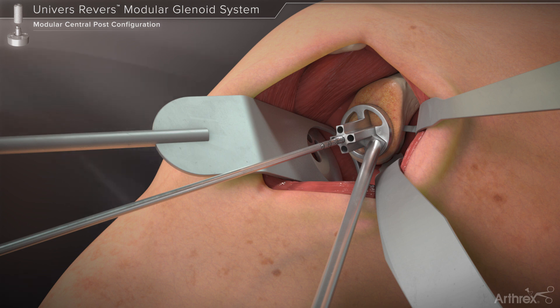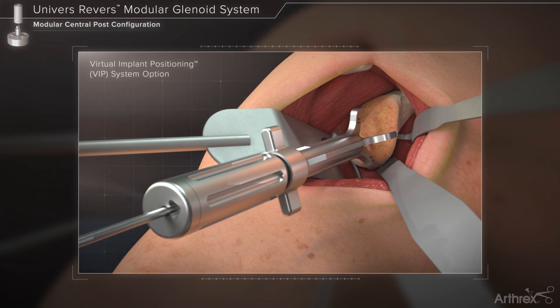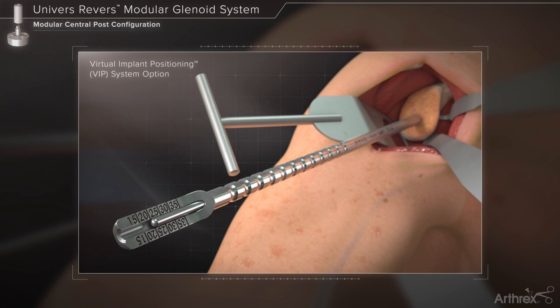A determination of the central post length can be made by noting the laser markings on the pin shaft. Alternatively, those using the virtual implant positioning system may orient the guide wire using the VIP glenoid targeter for enhanced accuracy. Measurement of the guide wire depth in the glenoid as it relates to central post or screw length may be determined through the use of the guide wire depth gauge.